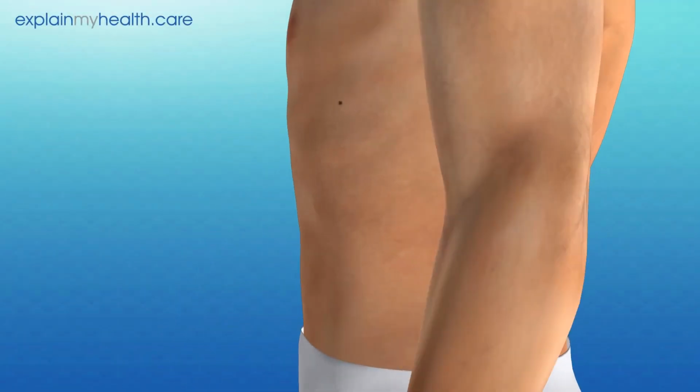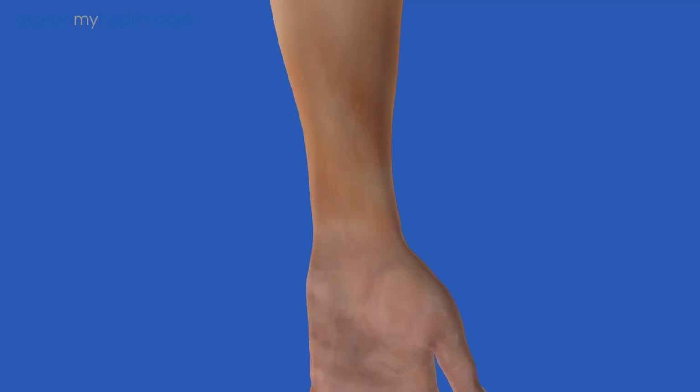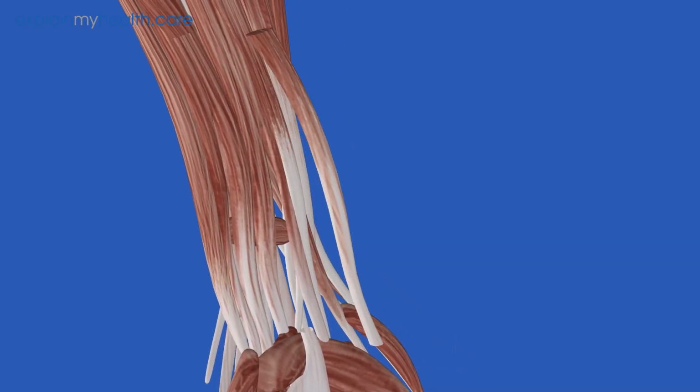If a ligament on the inner surface of the elbow is damaged, it may need surgical repair. 1 or 2 incisions are made on the skin. A portion of a tendon is removed and prepared for use as a tendon graft.